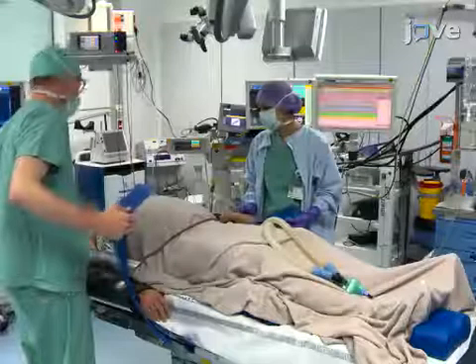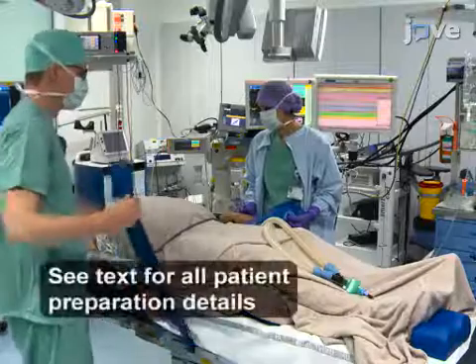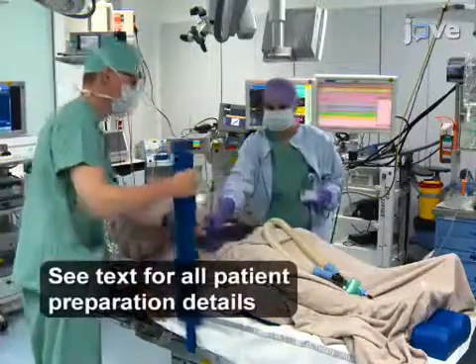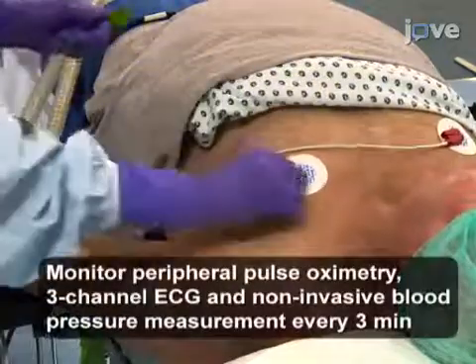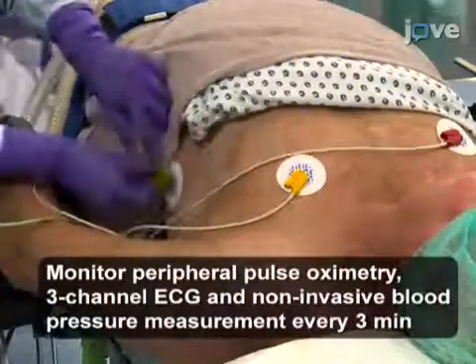Begin by helping the patient into the supine position on the operating table. Then have the anesthesiologist connect the vital sign monitoring system on the left side of the patient and wipe the patient's forehead with disinfectant.